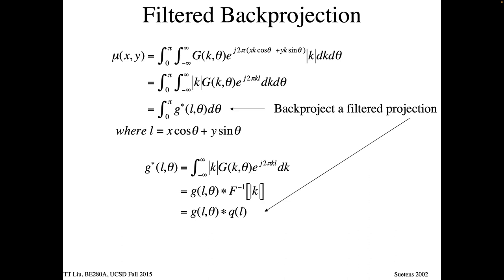So what does k look like as a function? Remember, we have all of these, our library of Fourier transforms, right? And so a Gaussian looked like this, it was a bell curve, right? We had a rect that looked like this, went up to one, came down to zero. k, it's just r if you're in polar coordinates, right? So it's just this. It's basically the absolute value of k, like y equals x, going up in all directions, right?